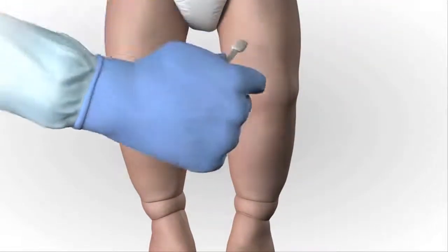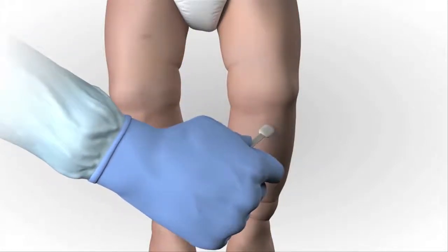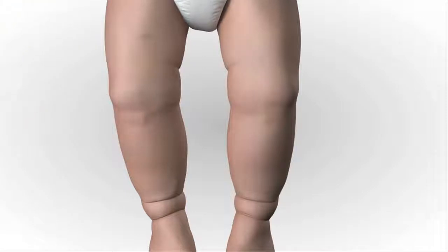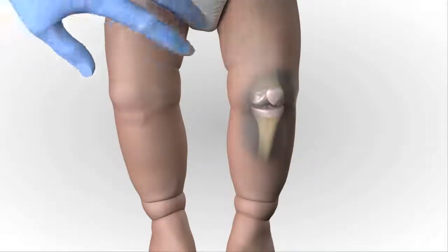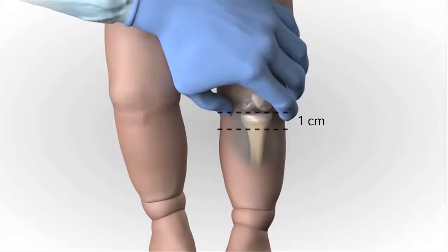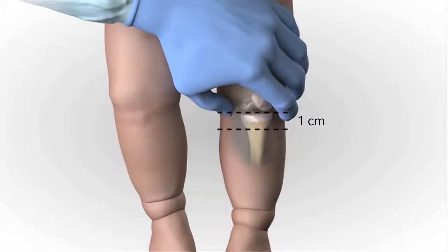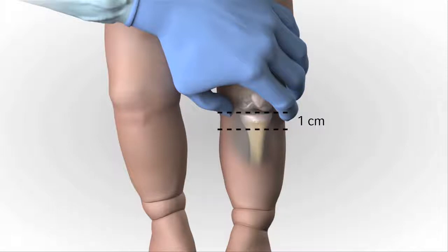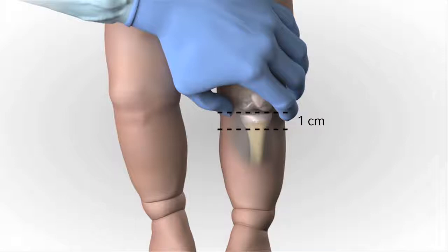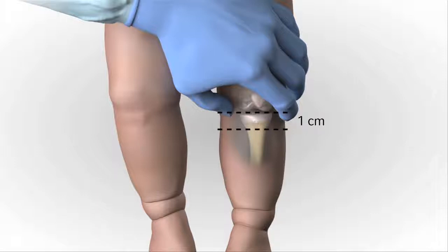Extend the leg. Prepare the site by using antiseptic of your choice. Use a clean, no-touch technique. The insertion site is approximately 1 cm medial to the tibial tuberosity, or just below the patella, approximately 1 cm and slightly medial, approximately 1 cm, along the flat aspect of the tibia. Pinch the tibia between your fingers to identify the center of the medial and lateral borders.